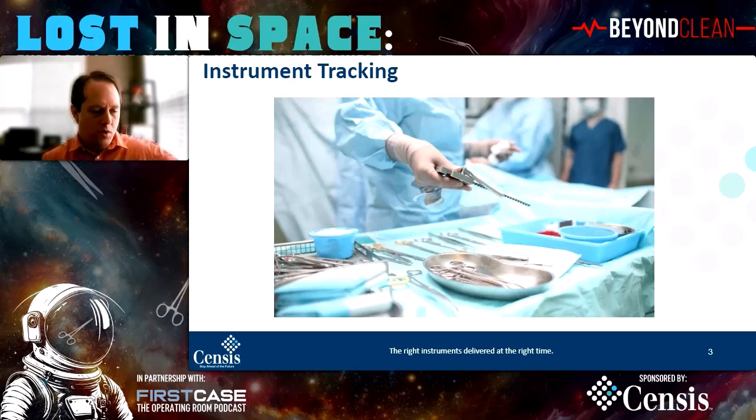So that's really when things come down from the OR and they hit decon, we're tracking them through the decon process into the washers. As they come out of the washers, we're tracking what's going and getting assembled. We track and collect data about sterilization. So as you put the trays into the sterilizer, you're scanning those into the sterilizer, and your modern instrument tracking systems are collecting not just what assets you have, where they are, but who's processing them, how long did it take to process those trays, and then the conditions of those trays.